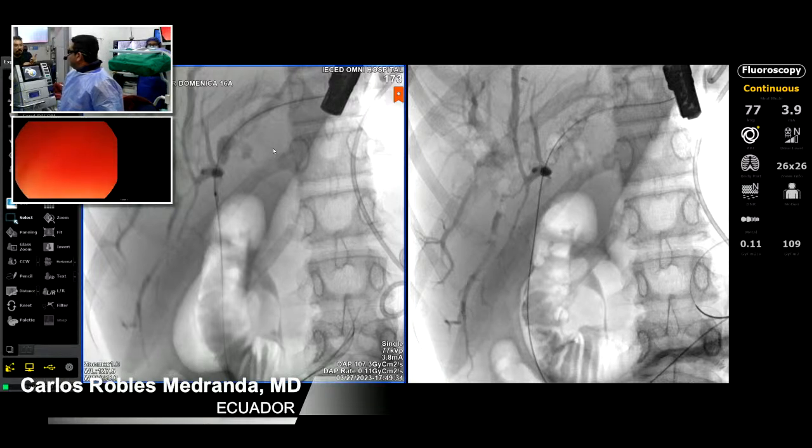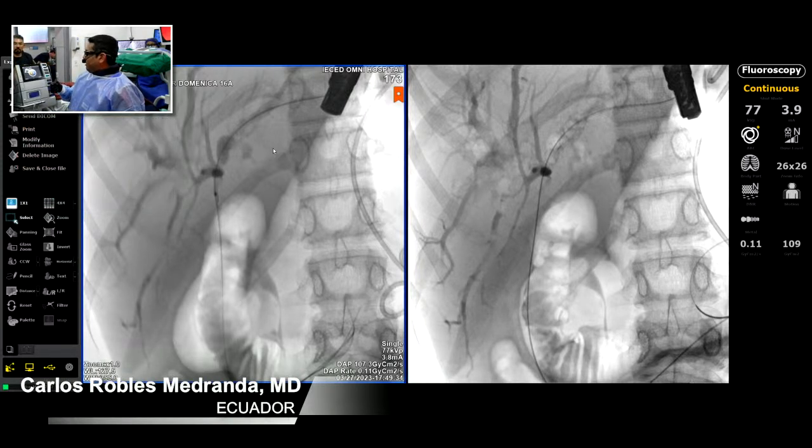Now I will do the calibration. Did you correct the position? No, I just fell inside. I think maybe the other stent was also on the way, and probably it was. Did you correct the position? No, I just had the chance.